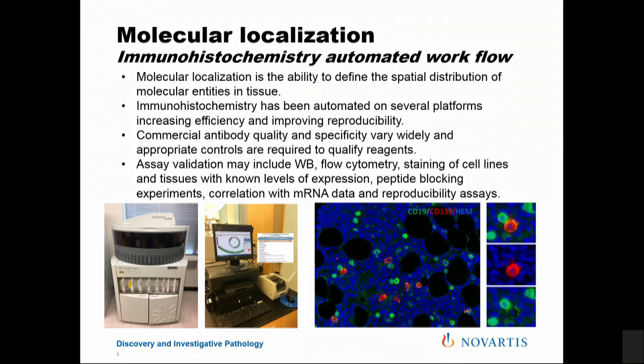I think a shortcoming of these assays still is the quality of commercial antibodies, and these can vary widely. An enormous amount of work has to be placed in validating an assay before it's actually used to assess tissues in an experiment or in a patient.